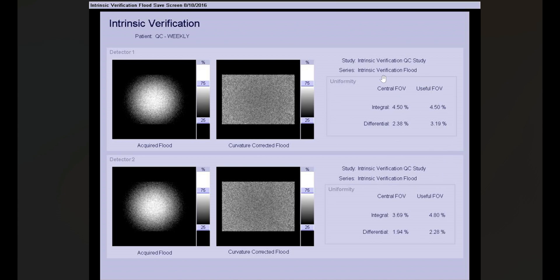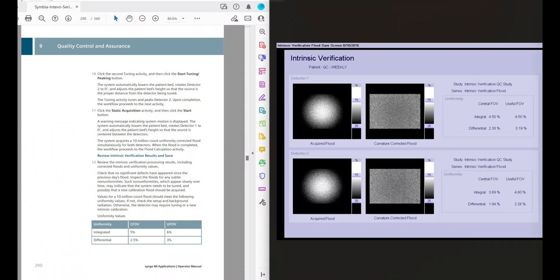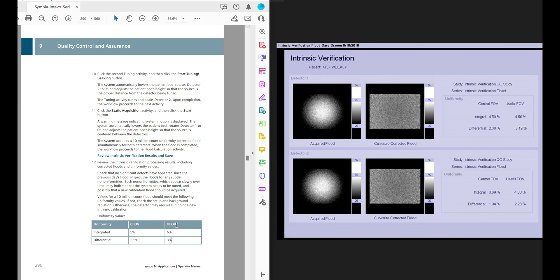The reason I bring this up is that there is no indication on the screen of this image that this flood actually didn't pass one of the criteria. Let's do a side-by-side comparing the intrinsic criteria against what was actually measured. We're fine with everything except the differential CFOV: the measured value is 3.19% yet the criterion is 3%. There's no automatic pass/fail flag — this is problematic with Siemens systems because you have to apply the manual criteria yourself to determine whether you pass or fail.